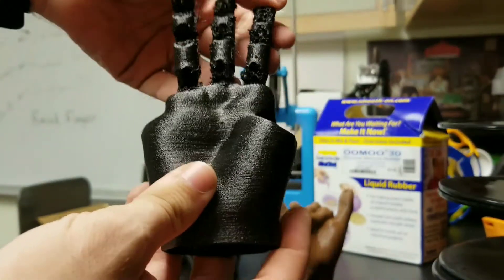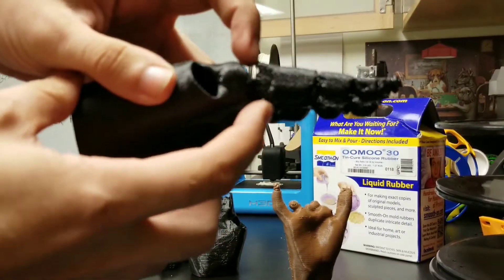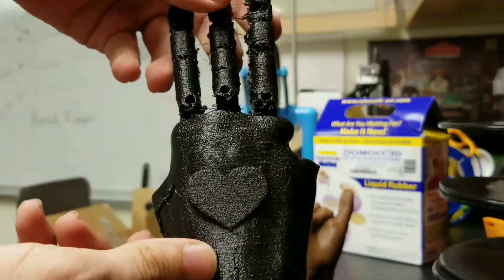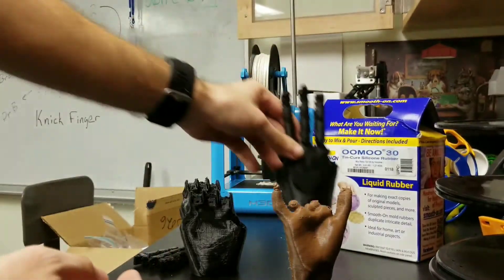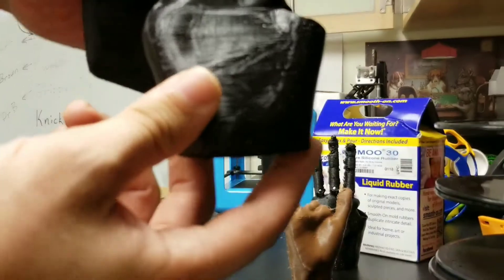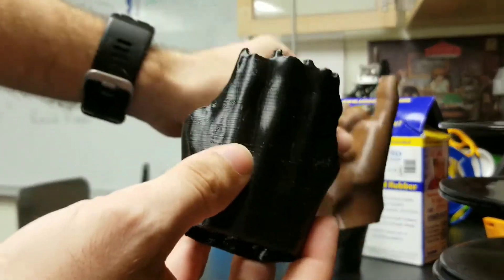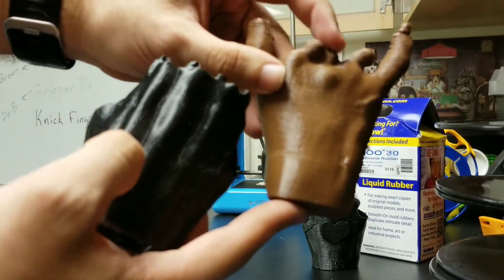What we're finding with this is our printer can't really print the orientation well. You can see the fingers have this attachment and it gets a bit rough up at the top, which makes it more challenging to print. So what we've done is taken this idea and created the gauntlet as a separate piece. We use MeshMixer to create a gauntlet that customizes to the individual's actual 3D scan, so there's room for the residual fingers you see up at the top.